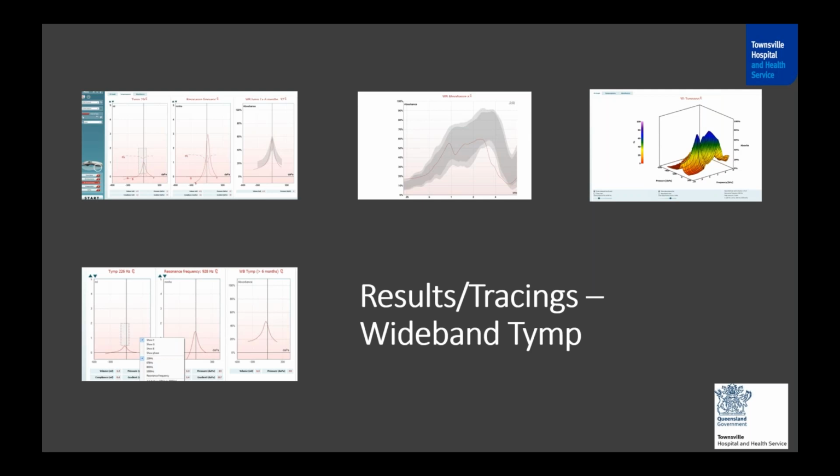So Madhuri, to answer your question, irrespective of what happens at the grommet, the middle ear structures still absorb some energy and they reflect part of the energy. So whether the grommet is blocked or not, we can still measure what's happening in terms of reflectance. Yeah, that's really interesting.